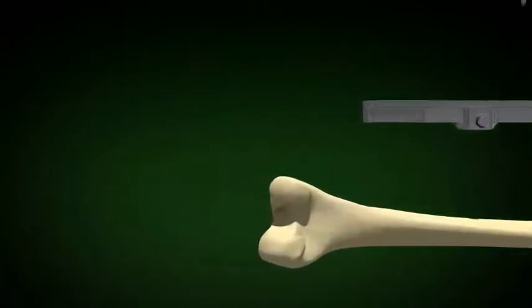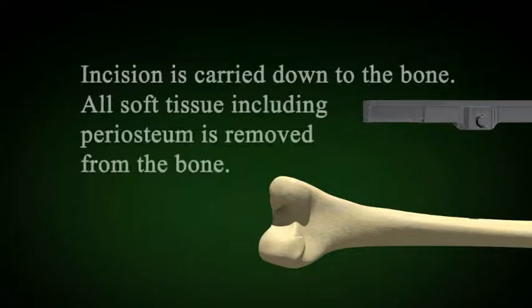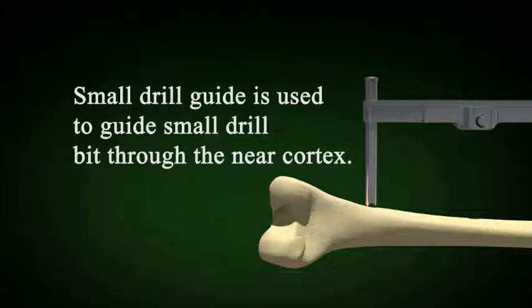The distal interlocking is done by first making an indent into the skin where you intend to make the skin incision. The incision is carried down to the bone and all soft tissue is removed from the bone. The cannula is then inserted directly on the bone. Do not hammer the cannula.